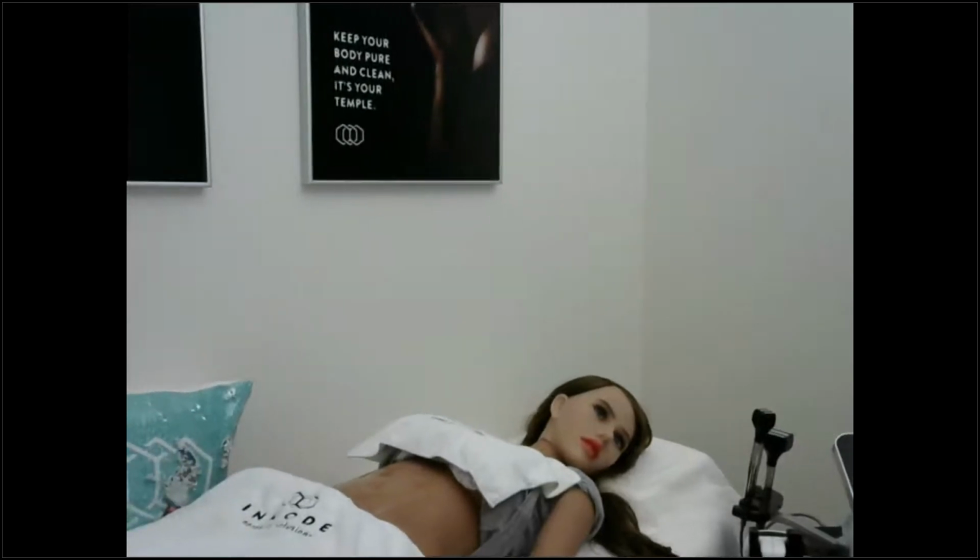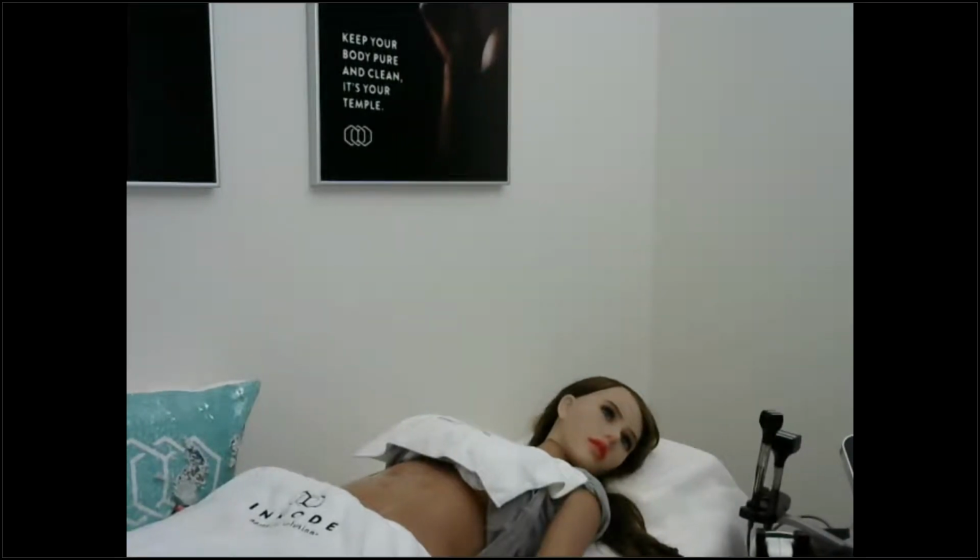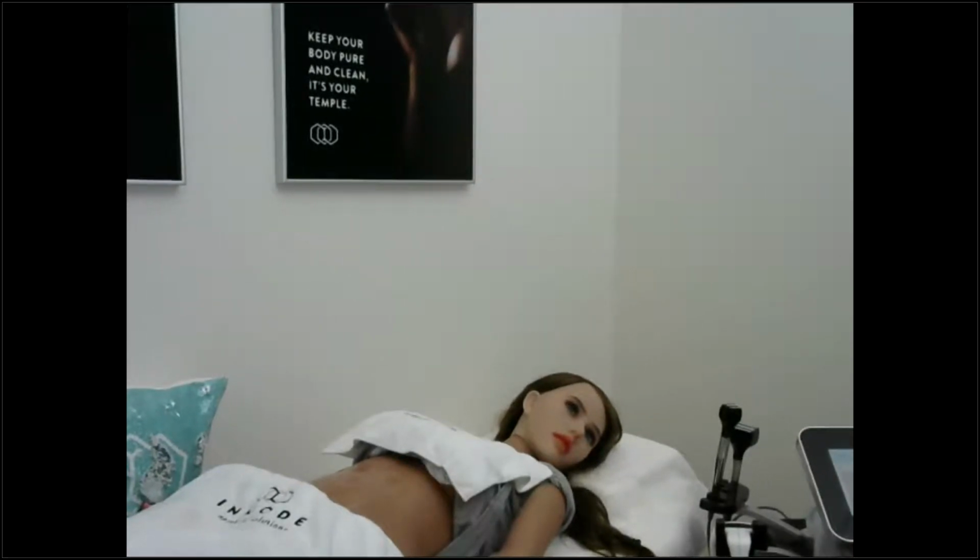So I see there was a question here. Thyroid cyst, contraindication for face. First of all, with regards to contraindication, you have a full list of the contraindications in the operating manual, and I urge you to read it. Second, a cyst that does not cause any unbalanced hormonal situation in the body, I would not treat immediately over the cyst, but it is possible to treat the face. If the hormonal situation is balanced, no problem.